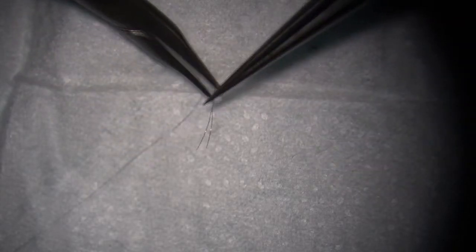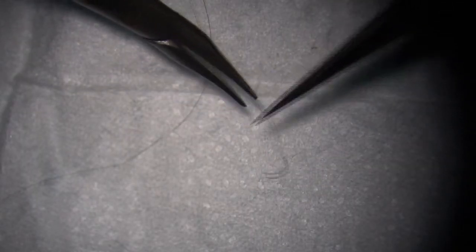So now the needle is on our left side, we use our left hand. If we still use our right hand to go to the left, it's not comfortable. So usually we pass the suture to our left hand, so we can pull it all the way out to the left.